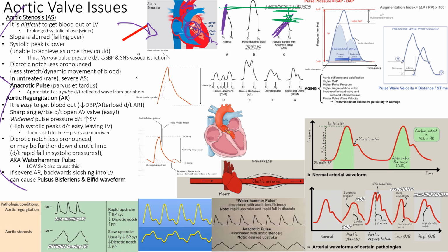It's going to vasoconstrict. So it's actually going to raise the diastolic blood pressure. So it's going to go up compared to where it was before, right? So that's going to do what to the difference between the systolic and diastolic? It's going to make it more narrow, right? So that's called pulse pressure, right? So the pulse pressure will be changed when you have aortic stenosis, for instance, right?